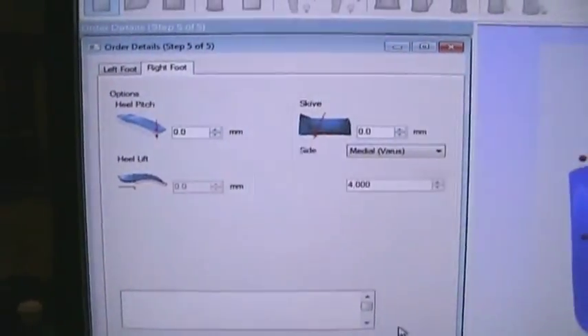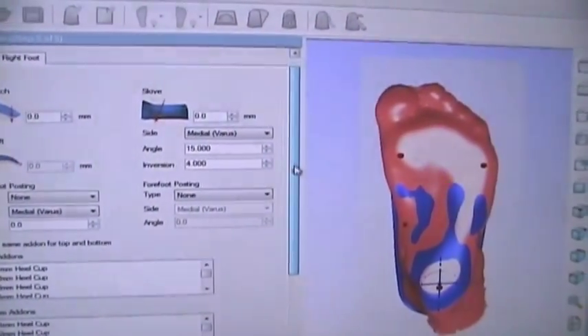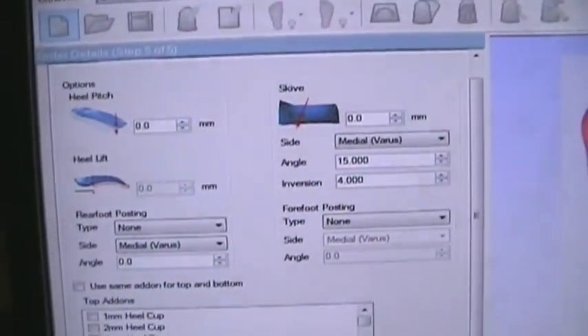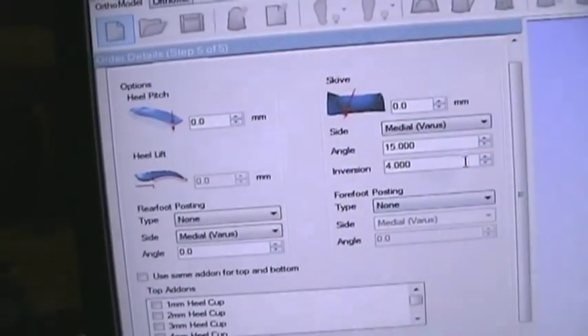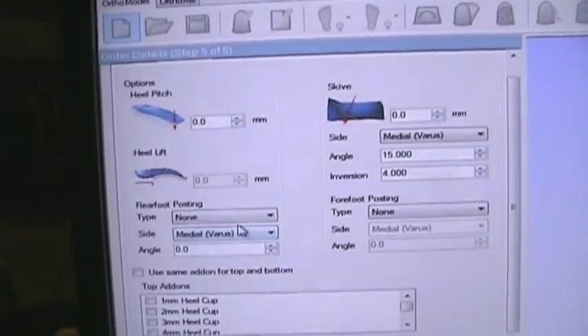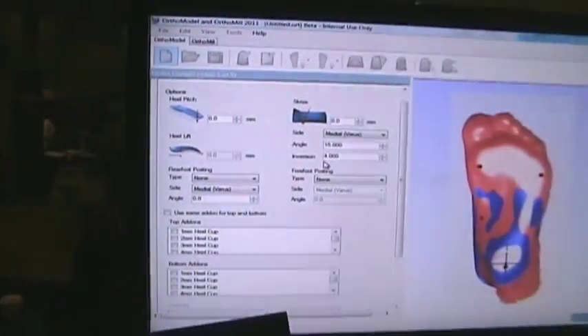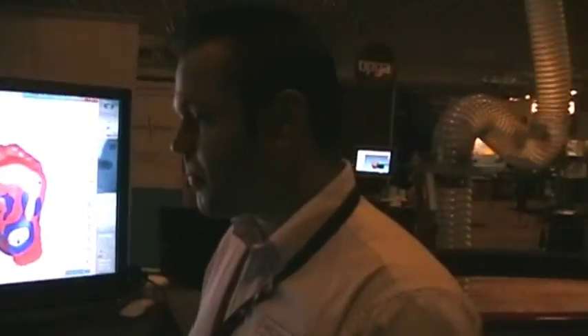Once we select next, we have options to modify the orthotic. We can add options such as heel pitch for high heel shoes, heel lift for leg length compensation, Kirby skive, and we can control the rear foot posts and forefoot posts independently — so we can add varus or valgus independently. And we're able to do all of this from the scan that we took just a few minutes ago. Correct.